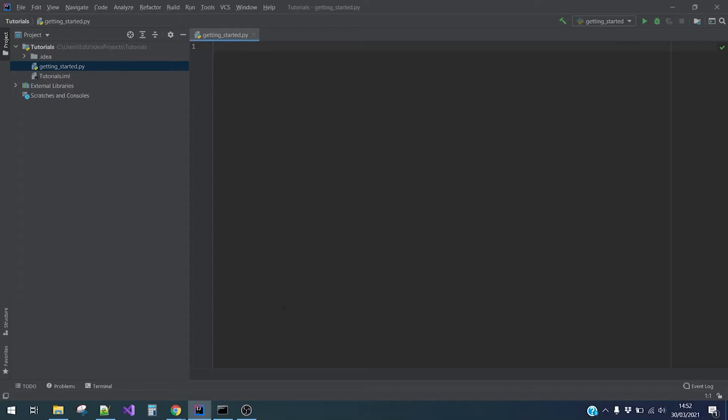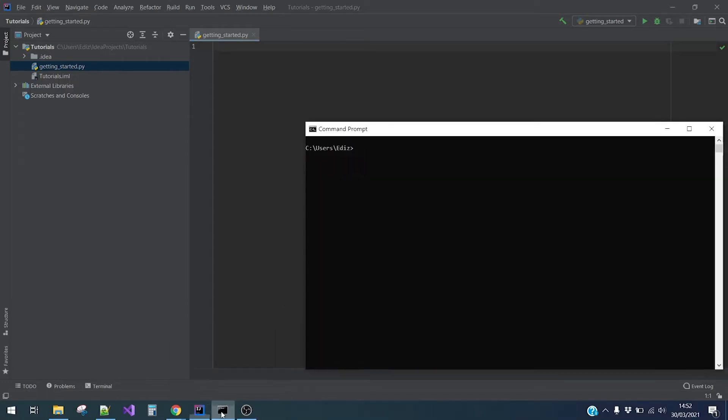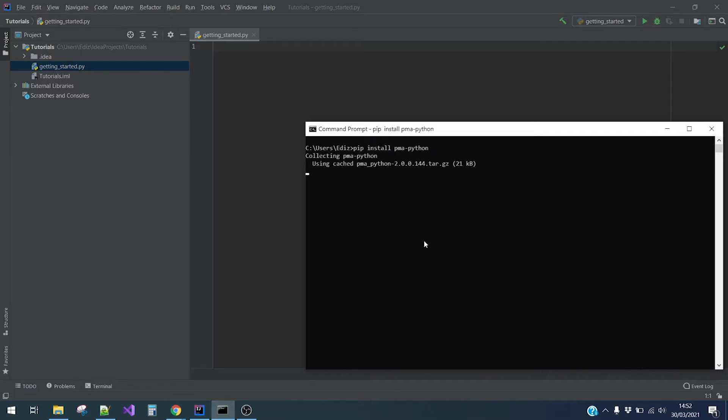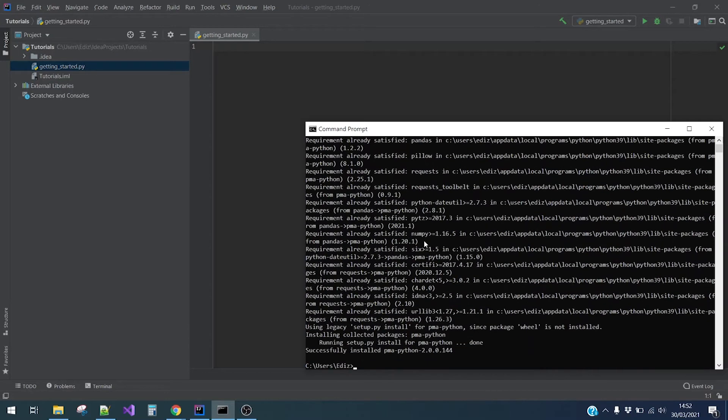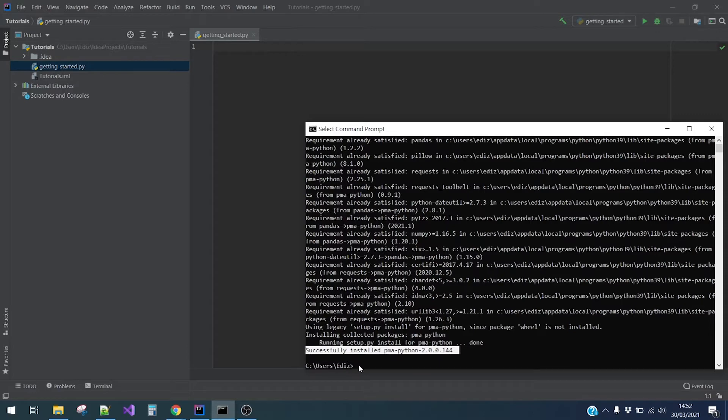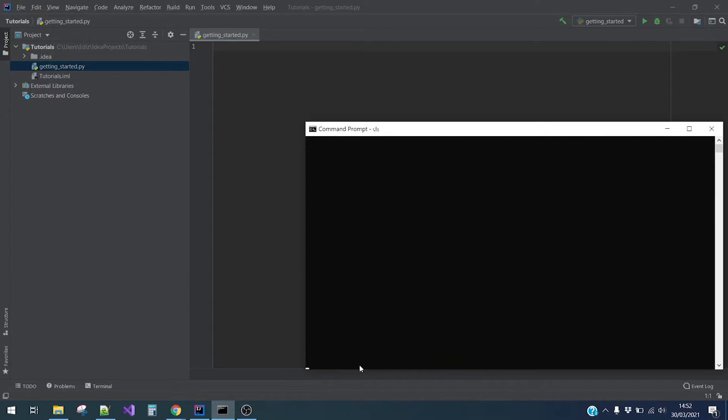Hi there, today I will help you getting started with our PMA Python SDK. Let us begin by installing PMA Python using PyPI. Type pip install PMA Python and hit enter. We can see here that PMA Python is successfully installed.